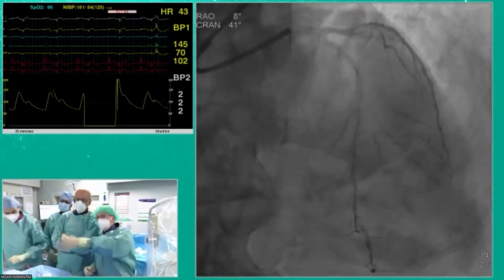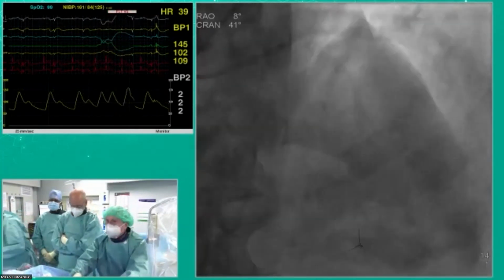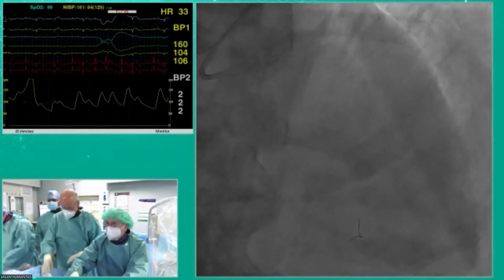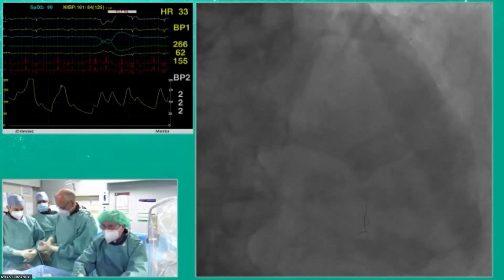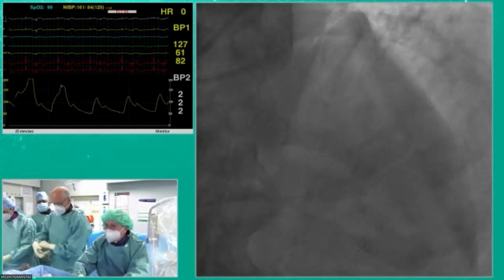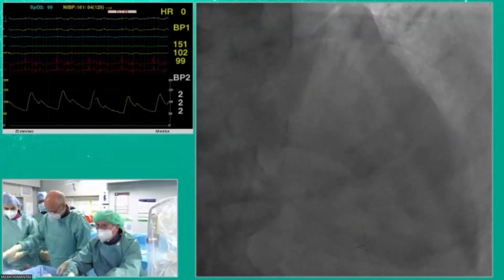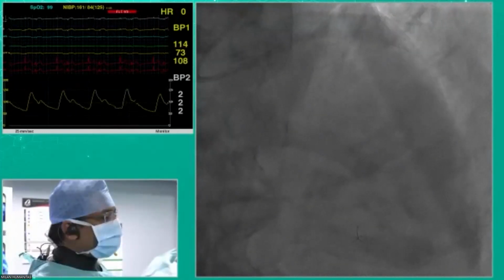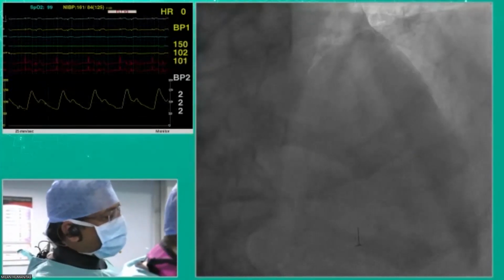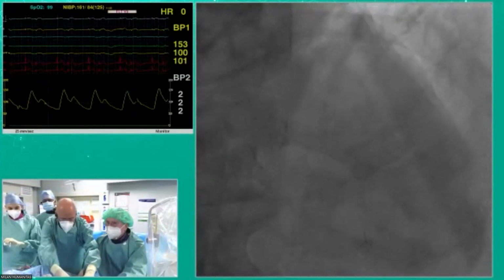Not bad. We can do drug-coated balloon, two drug-coated balloon case finished. So tell us your thinking here, Dr. Colombo, between a drug-coated balloon or a stent, and how do you approach that? I make the decision according to the angiographic result. Sometimes I use IVUS, but if the angiographic result is very acceptable, I take it.